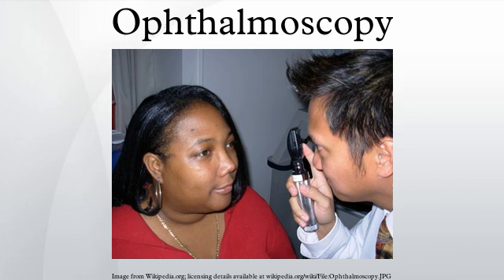Ophthalmoscopy is a test that allows a health professional to see inside the fundus of the eye and other structures using an ophthalmoscope. It is done as part of an eye examination and may be done as part of a routine physical examination. It is crucial in determining the health of the retina and the vitreous humor. An alternative or complement to ophthalmoscopy is to perform a fundus photography, where the image can be analyzed later by a professional.